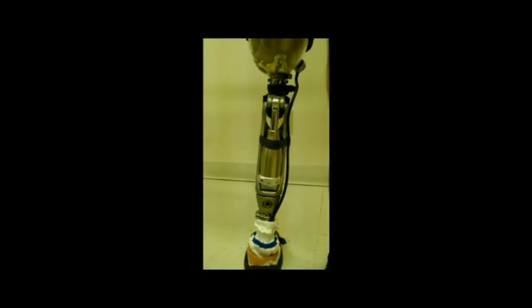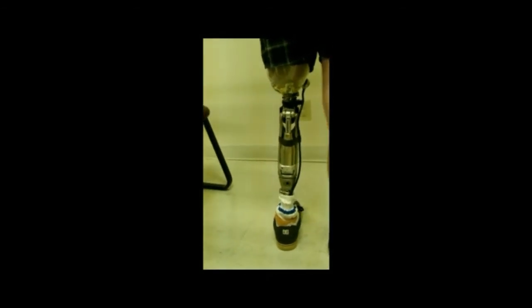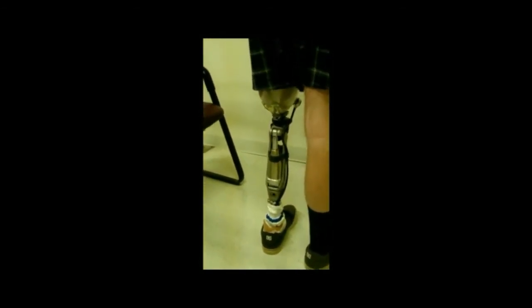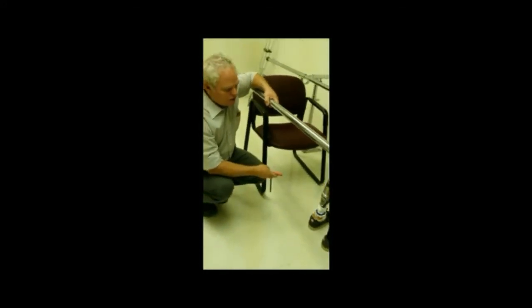This bar is pointing to the stairs. That's walking mode. When this toggle goes to the middle, that's locked, and that's free swing. This knee is not designed to walk in free swing or in the lock mode. It's designed to walk in the walking mode, the stair setting. You can walk in both of those in short term, but it's best to be in the walking mode to use the knee.